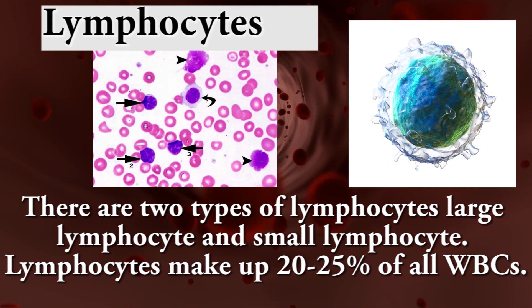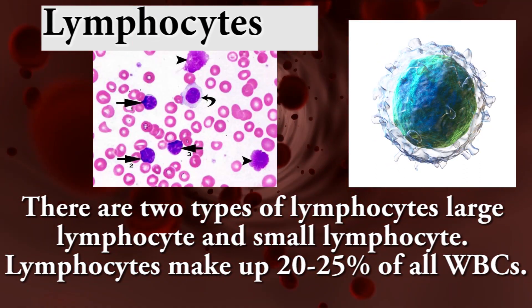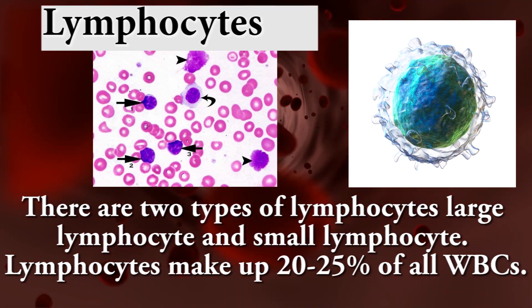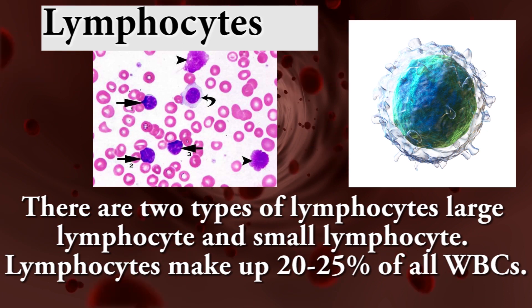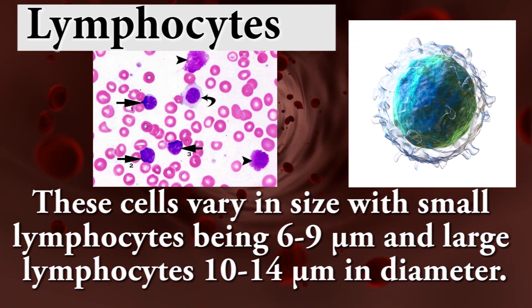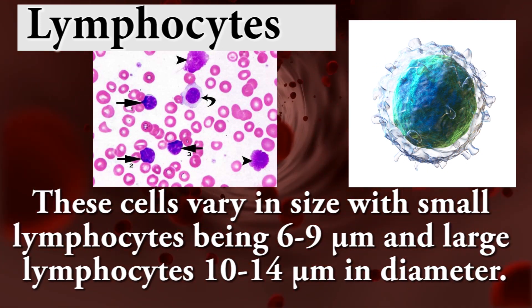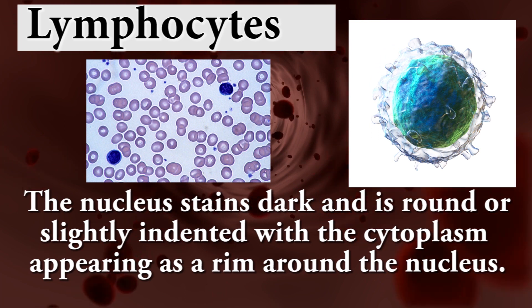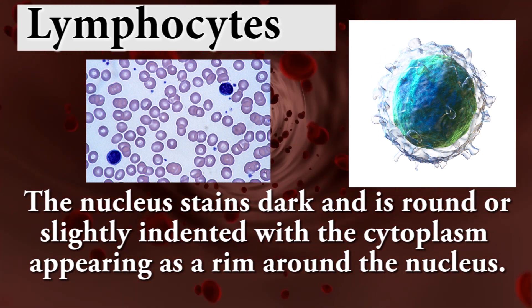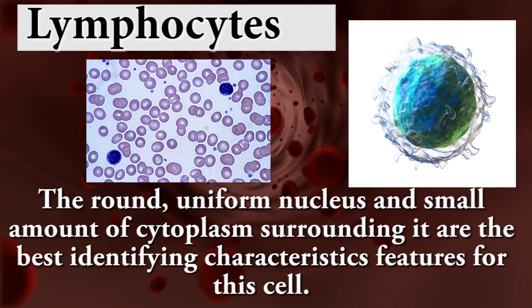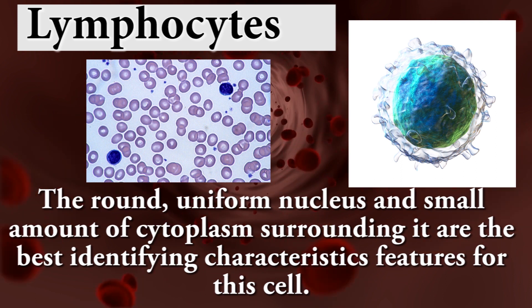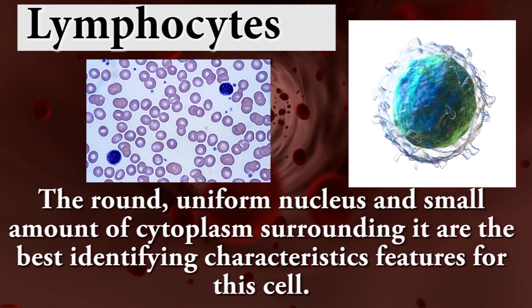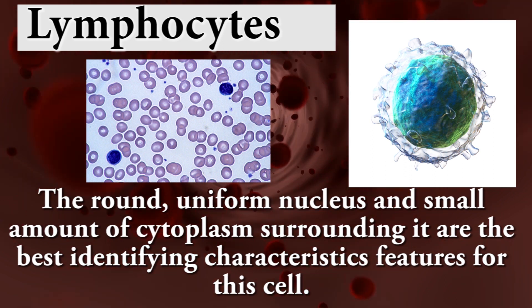Lymphocytes — there are two types: large lymphocyte and small lymphocyte. Lymphocytes make up 20 to 25% of all WBCs. These cells vary in size, with small lymphocytes being 6 to 9 micrometers and large lymphocytes 10 to 14 micrometers in diameter. The nucleus stains dark and is round or slightly indented, with cytoplasm appearing as a rim around the nucleus. The round uniform nucleus and small amount of cytoplasm surrounding it are the best identifying characteristic features.